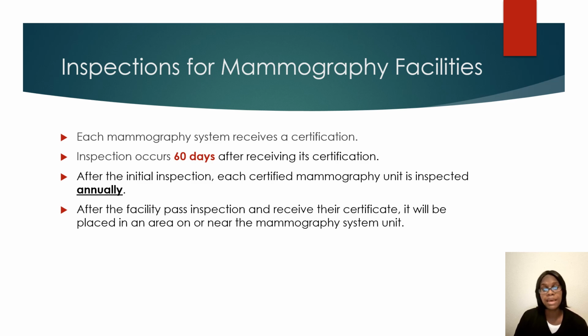After the facility passed inspection and received their certificate, it will be placed in an area on or near the mammography system unit. So whenever I'm working and whenever you work, check beside your mammography unit. I see a form or a paper. It's like a certificate. It's saying that, hey, it passed, it's certified. I see it on the wall beside the mammography machine.